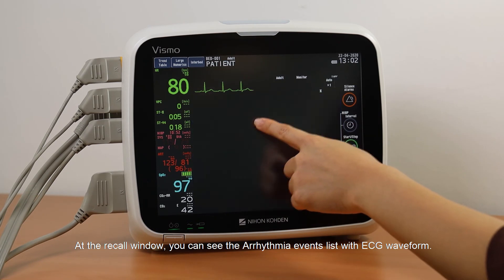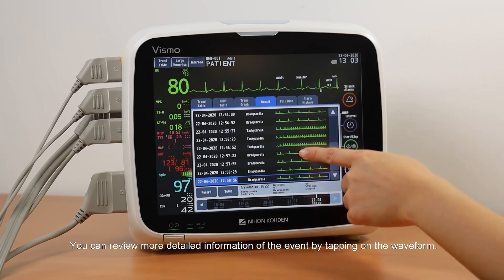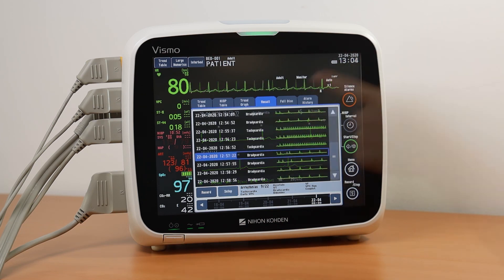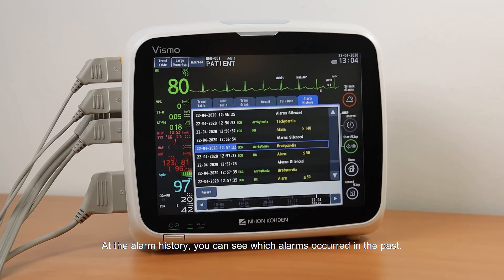At the Recall window, you can see the arrhythmia event list with the ECG waveform. You can see or review more detailed information of the event by tapping on the waveform. At the Alarm History, you can see which alarms occurred in the past.